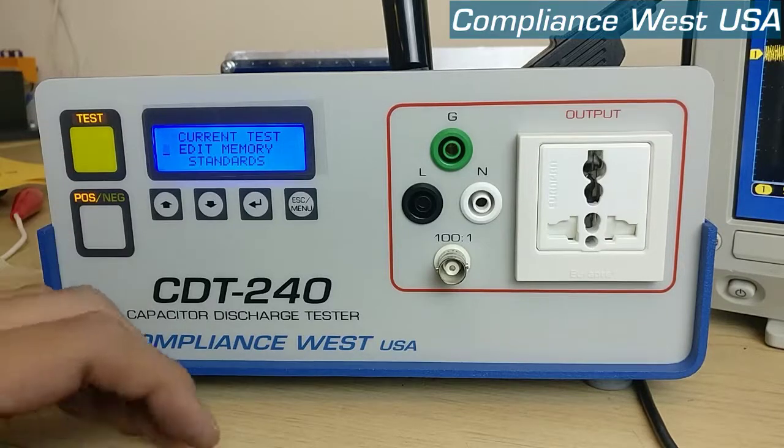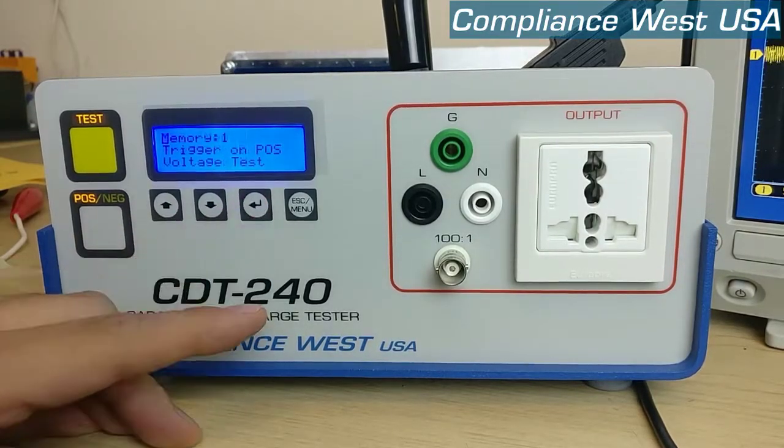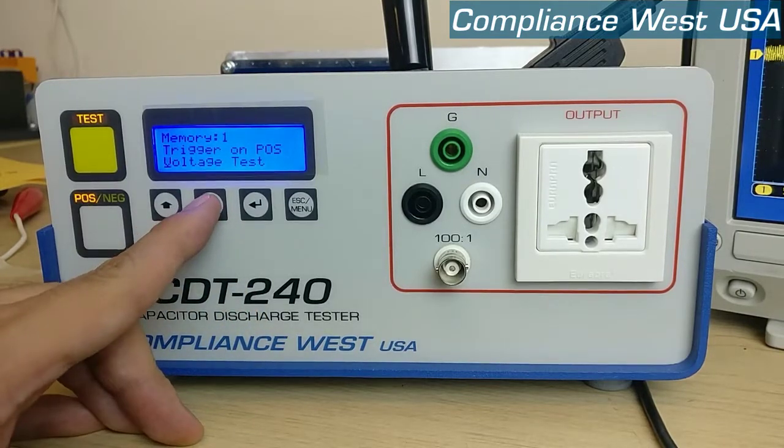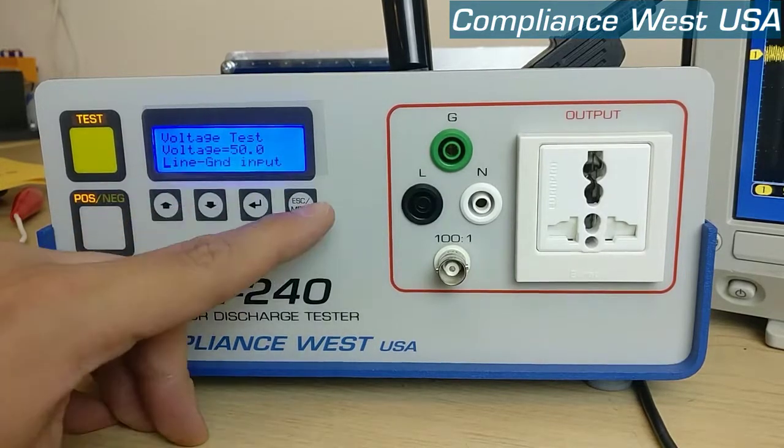First we need to check the settings of the CDT, so let's go to edit memory, edit memory 1, and we need to have trigger on positive, a voltage test with a voltage level of 50 and from line to ground.